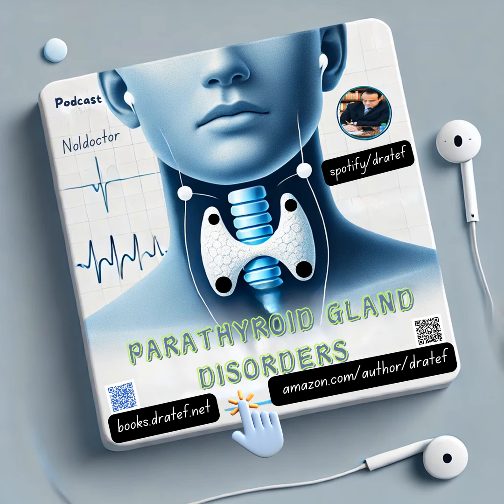Are there any other futuristic advancements you're particularly excited about? One that I think has huge potential is continuous PTH monitoring. Continuous, so not just taking blood samples at certain times. Exactly. It would provide a constant flow of PTH data throughout the entire surgery. That sounds incredible. Why is that so beneficial? Well, surgeons would be able to catch even the tiniest changes in PTH levels, which could lead to earlier detection of any problems. And that means they can make even better decisions during surgery. It's like having a constant pulse on what's happening.